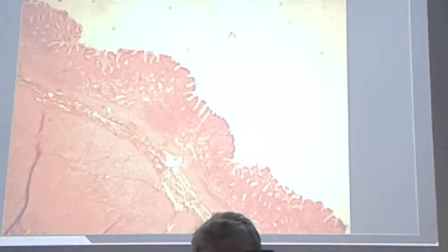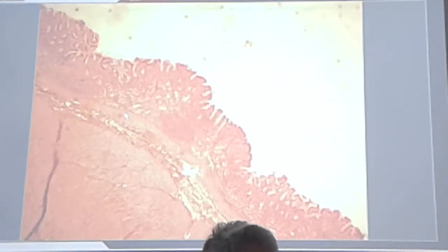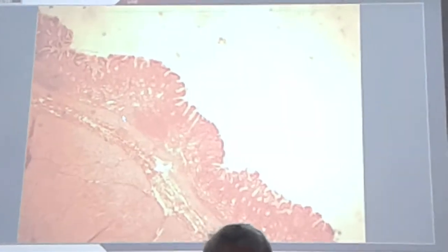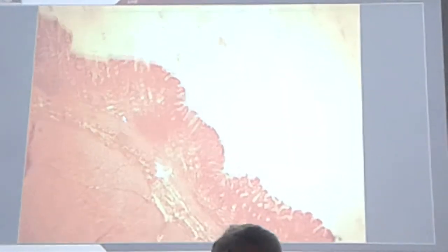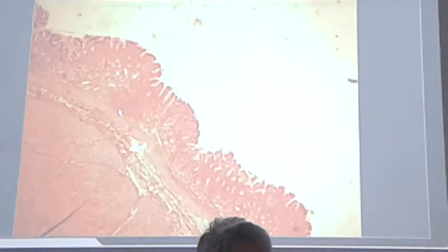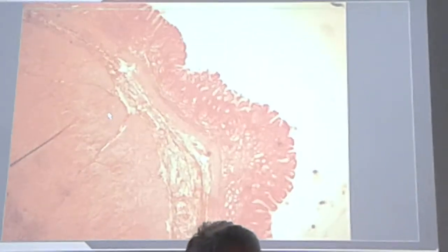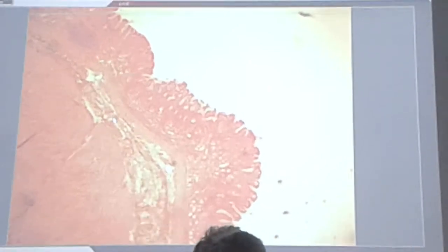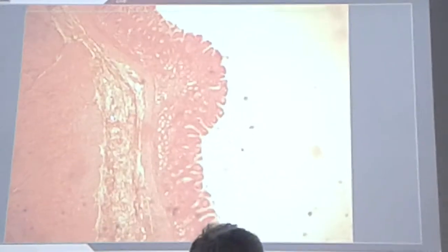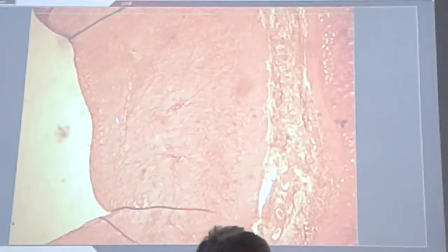Now, first of all, we identified the mucosa, and through this low magnification, we can still observe the other layers. The mucosa includes the lamina propria and extends until the submucosa. Here, the connective tissue elements, as you see at the tip of the arrow, the submucosa, and then the muscularis externa, having a broad, thick layer.